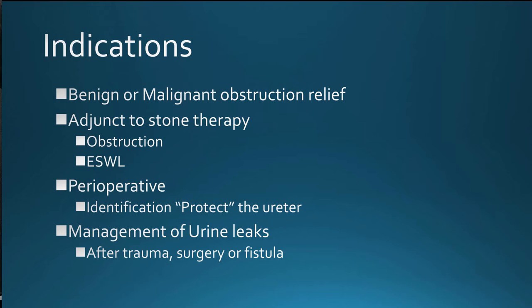I'll just briefly mention a couple other indications. One of which is when there's been an injury to the collecting system or ureter after trauma, usually penetrating trauma or iatrogenic injuries from surgery.